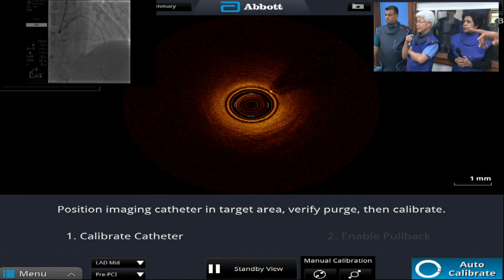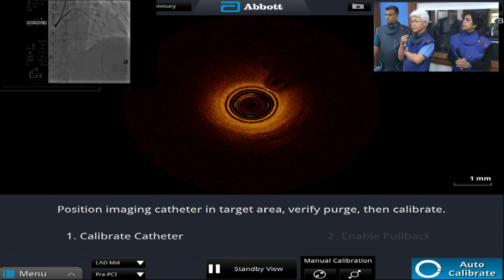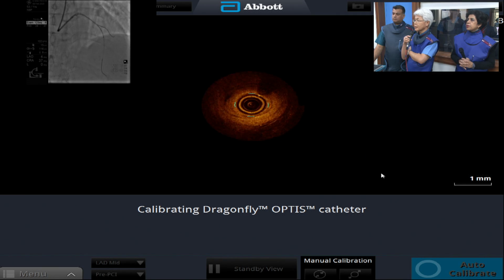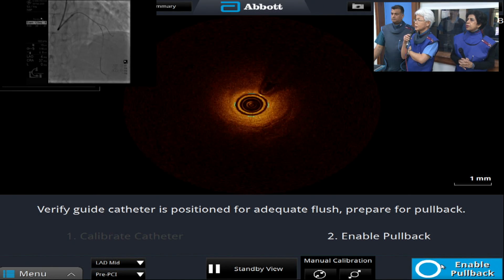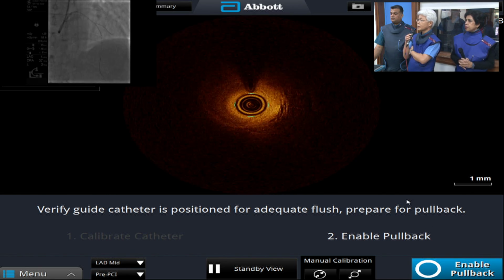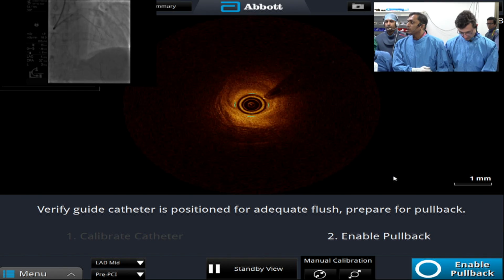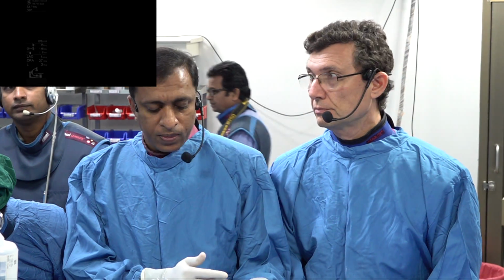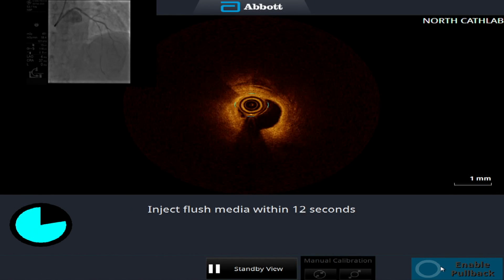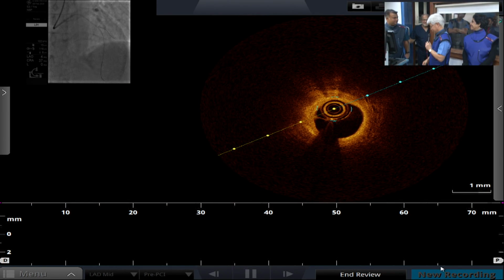Yes, that's right. Just check it once. Oh, it's too hard to inject. Okay. Let's see if we're in the proper guiding catheter position. Just a quick puff. Wait. A little bit. Puff there again. Yes, perfect. Okay. Ready? Fluoro. It's okay, fine. Yes. Okay, all right, good. Oh, it's come very late. Good, very good.